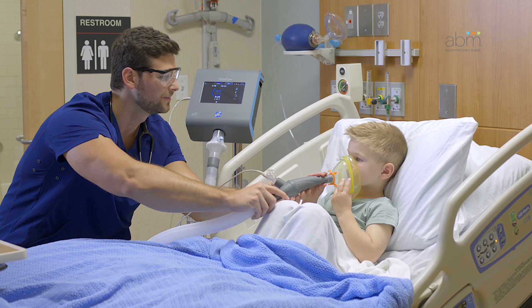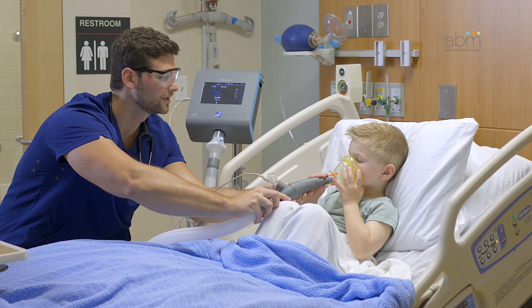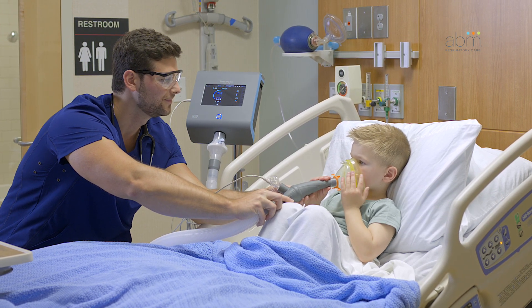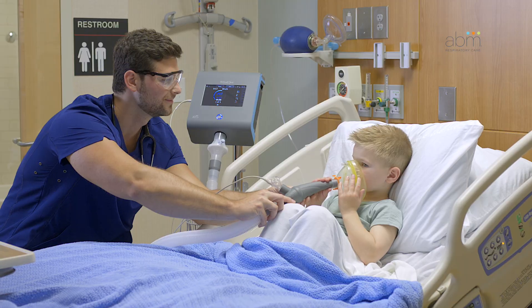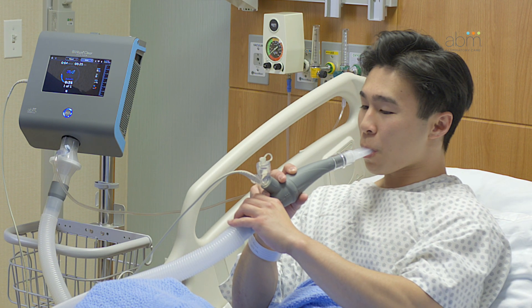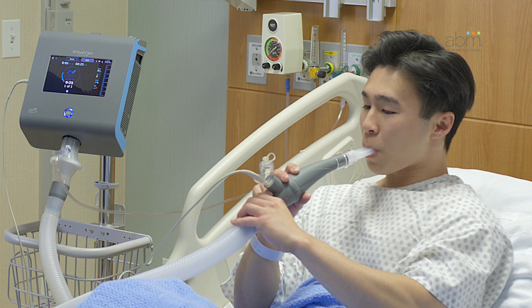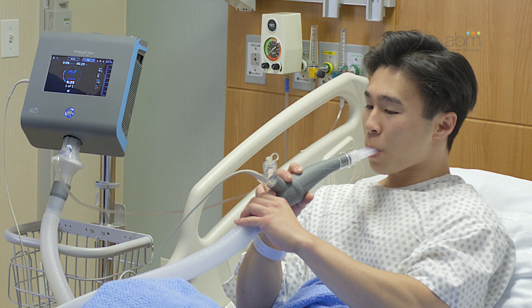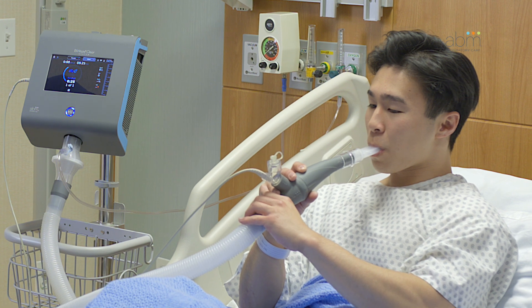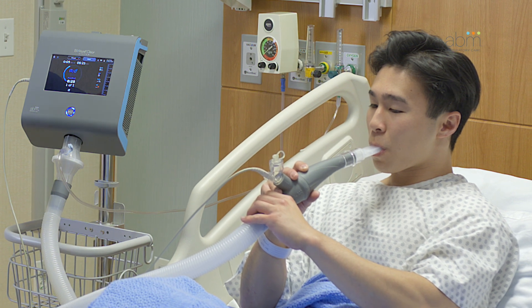If the patient is using a face mask, ensure it is tight against their face without any leaks of air. If the patient is using a mouthpiece, ensure they are making a tight seal and keeping their cheeks in. You can also use a nose clip if needed.